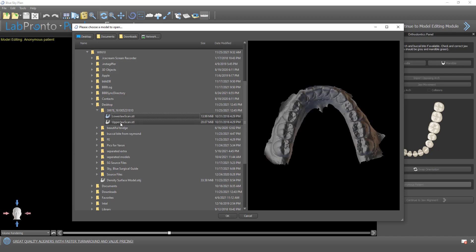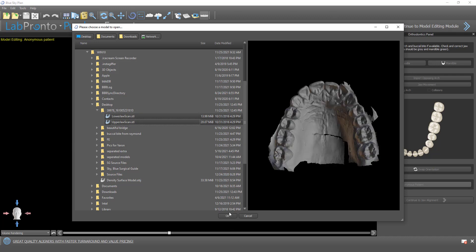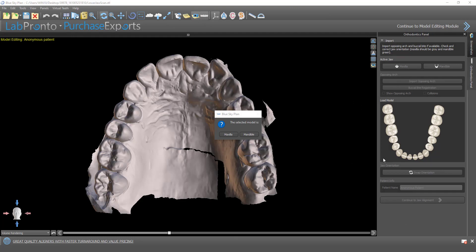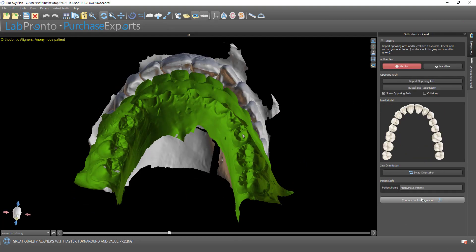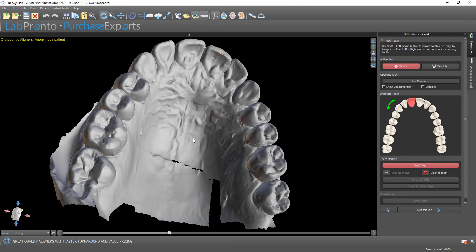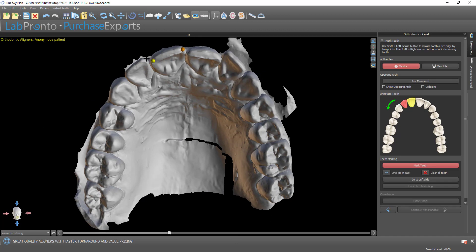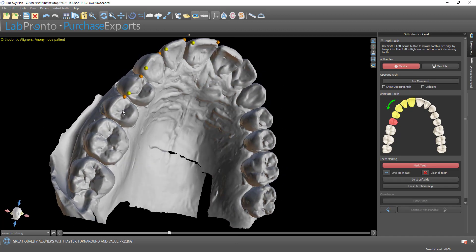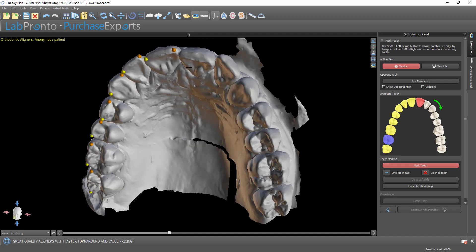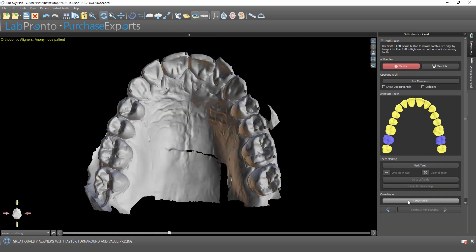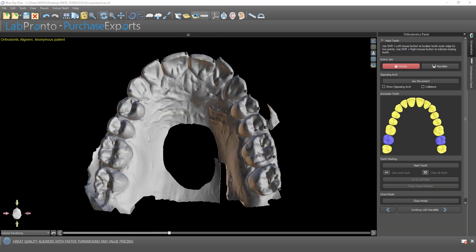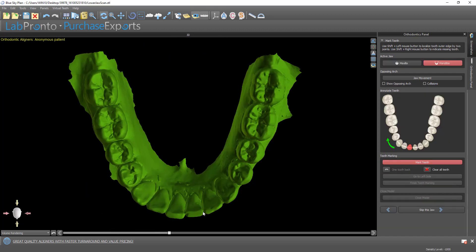I'm going to select the relevant models and mark the teeth very quickly. Right click to indicate the missing tooth, either side shift and left mouse button to click, mark the teeth and continue with mandible mark teeth.